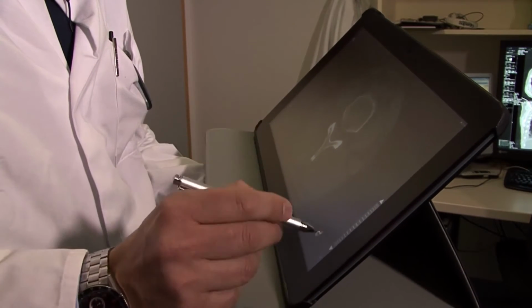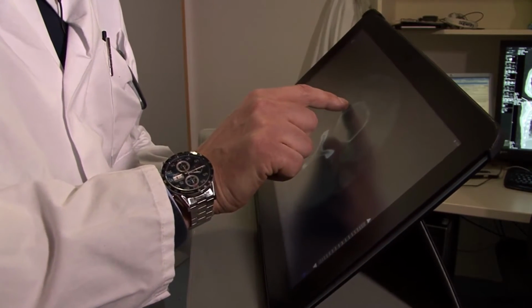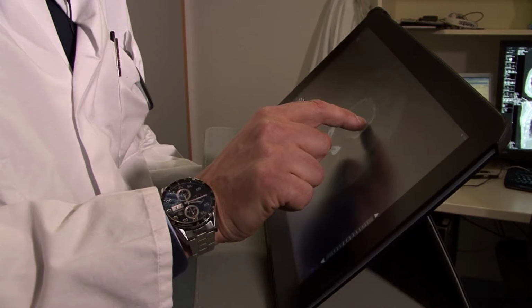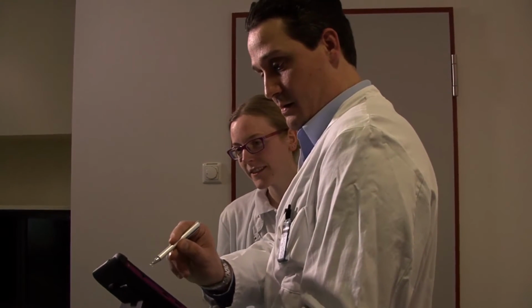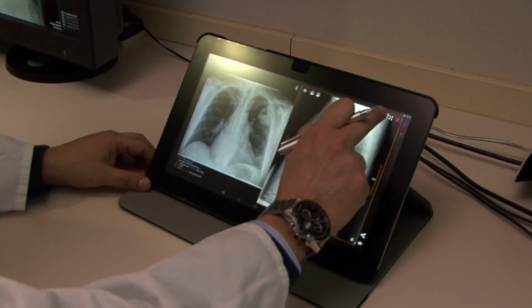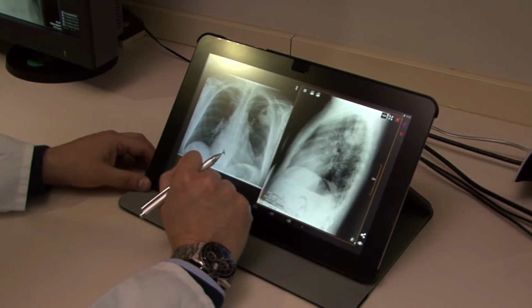And another option might be some remote assessment of imaging and remote peer review, for example. Portable devices will come and bring up a new exciting feature to the market because we need them definitely. We need devices that are DICOM enabled because this is a specific question for us to see these images with special grayscales, and therefore we do believe that these devices will come up within the next few years a lot.